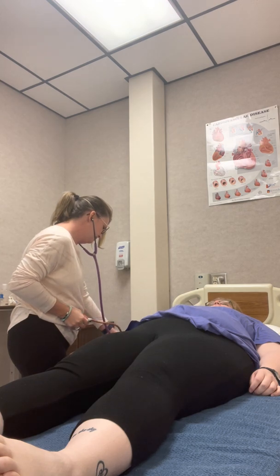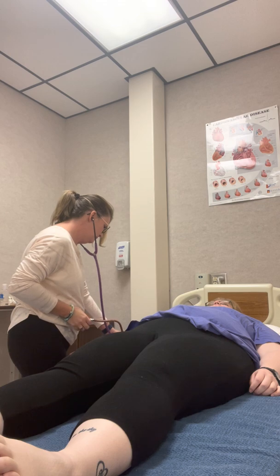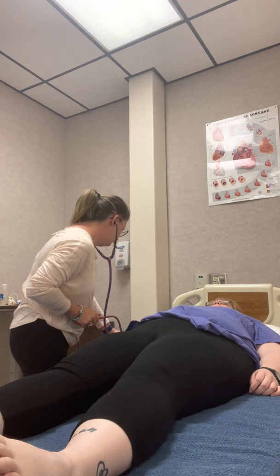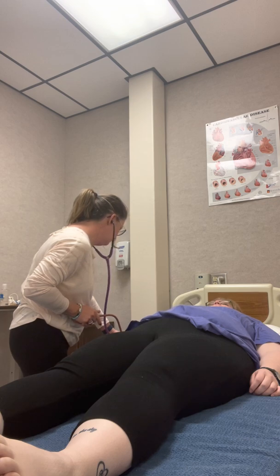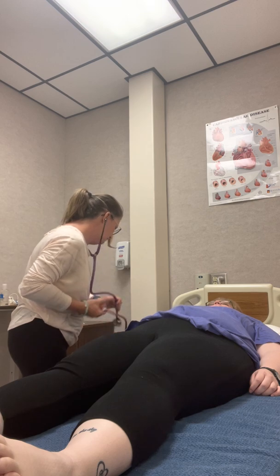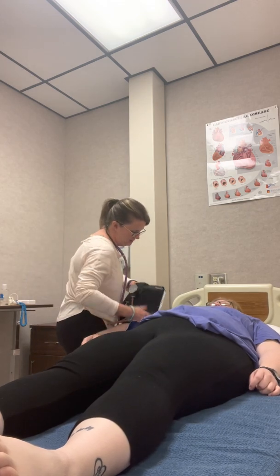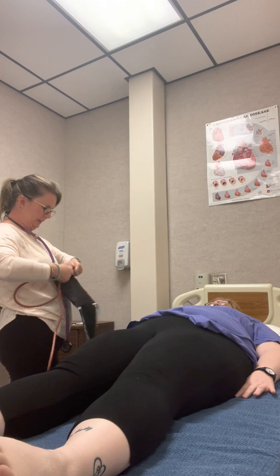Do you have a preference as to which arm I take your blood pressure? It doesn't matter. Actually, what I might do is pull it all the way down so it's nice and flat, so there's less room. There you go. Nope, you're good. 118 over 68. Nice. Very nice. Those are some good numbers. Good to hear.